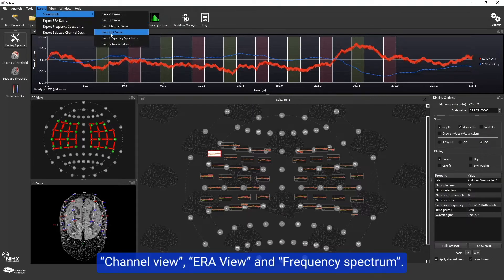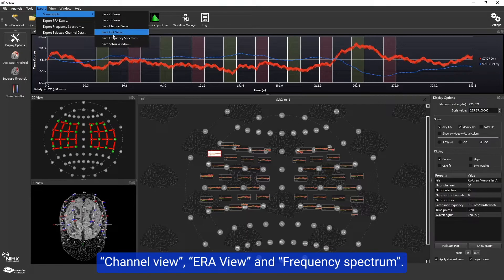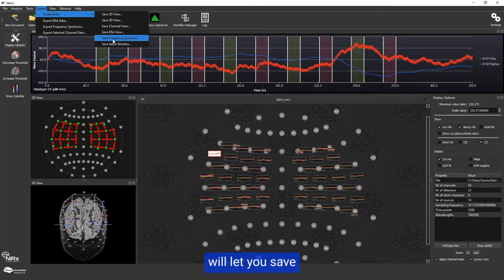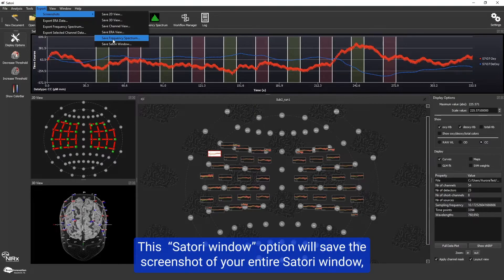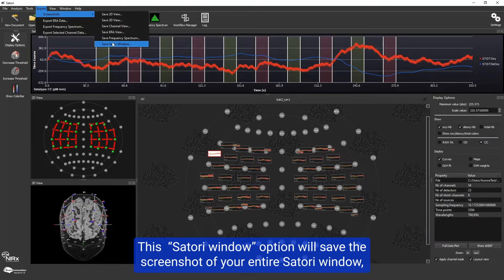Channel view, ERA view, and frequency spectrum will let you save the image that you see in these respective windows in Satori. The Satori window option will save a screenshot of your entire Satori window.